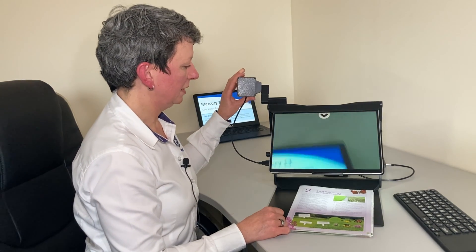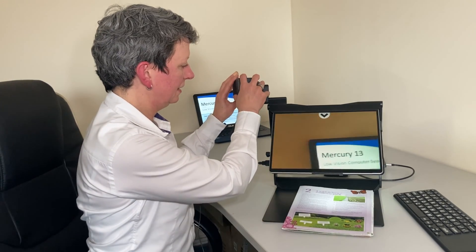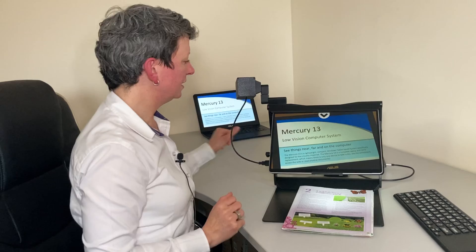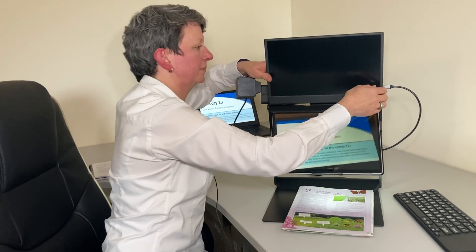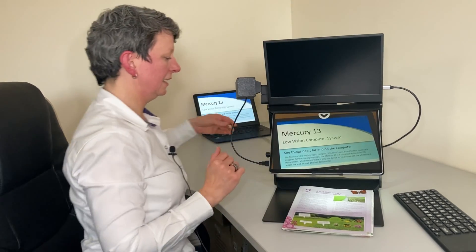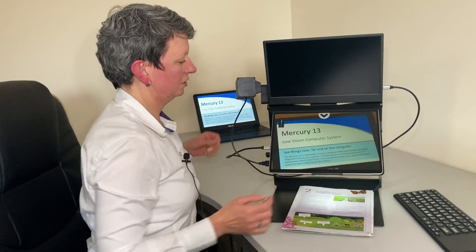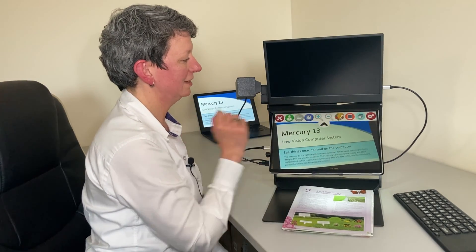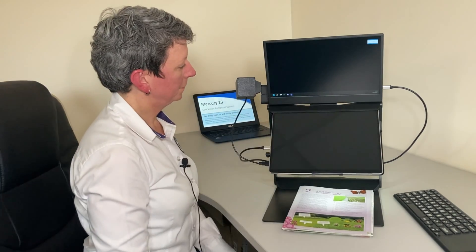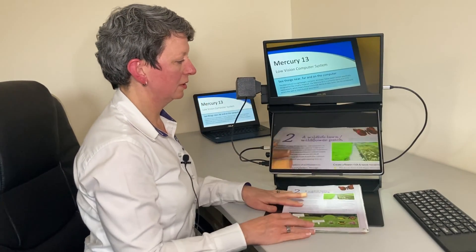I can look at my whiteboard presentation and organize the view so it's a bit straighter. If I have the second screen, I can slot that into the stand and plug that into the other USB-C connection on the tablet. Now I can do a split screen, with distance magnification on the top screen and my book below.